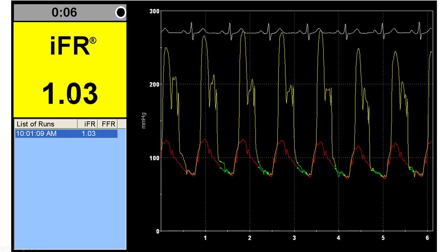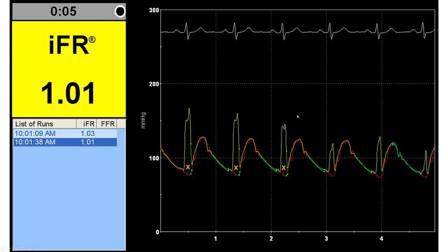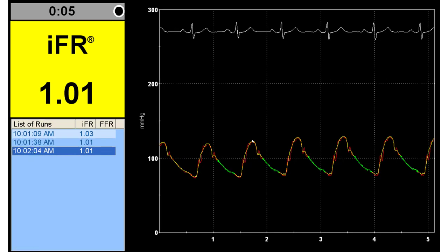Clearly, there cannot be a resting or hyperemic index greater than 1.0. This is an example of artifact in the pressure wire, making it an invalid measurement. There is also another example of artifact in the waveform, which usually requires repositioning of the pressure wire — after which it resolves and the measurement looks good.